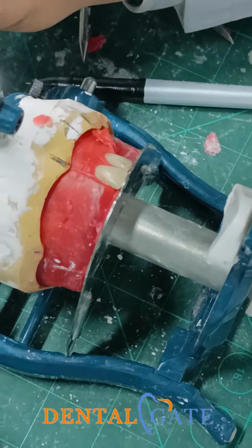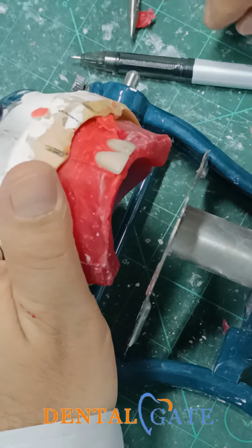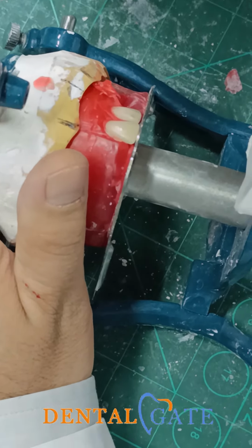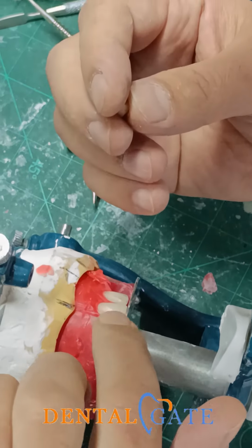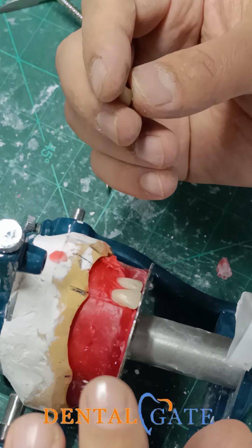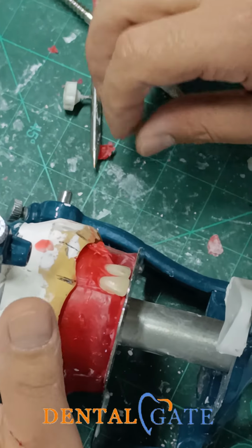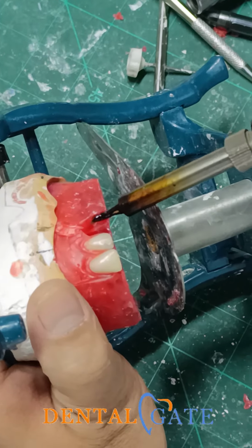So take more care with the canine, please. Generally, we need to make contact with the tip only, okay? Within the tip only, and we have contact with the central as well as the canine. Just the lateral should have no contact. Make sufficient space for the canine.